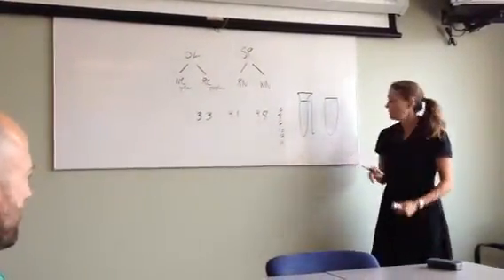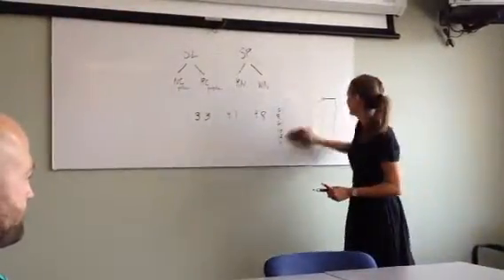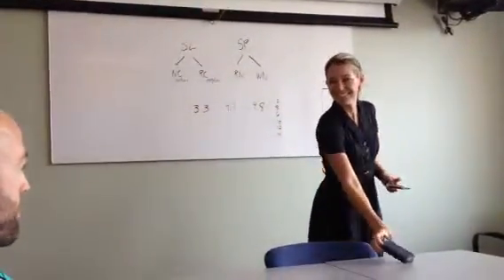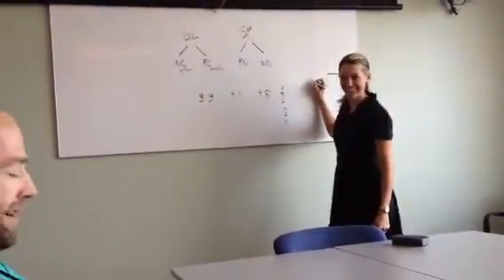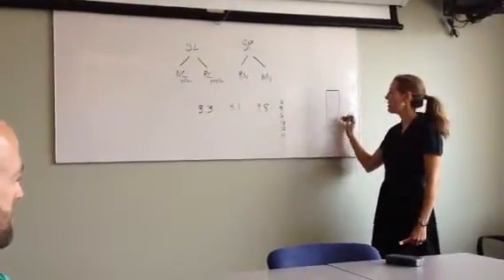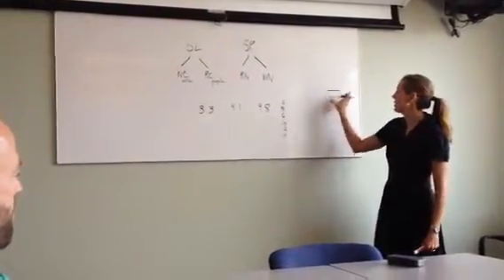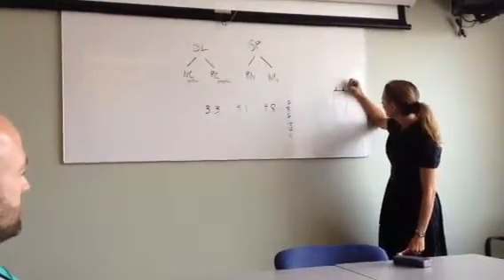Right. Our bone level implants are platform switched. What does that mean? The diameter of the implant is wider than the diameter of the abutment. Yes, the diameter of the implant is wider than the diameter of the abutment. So the abutment would be about here.